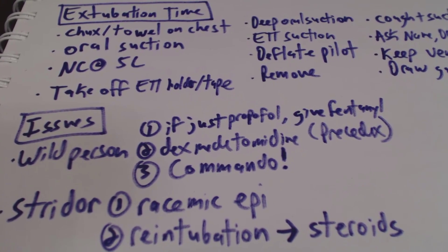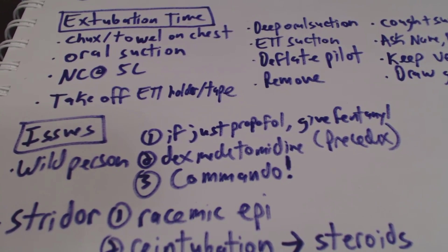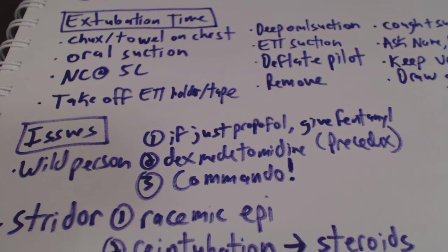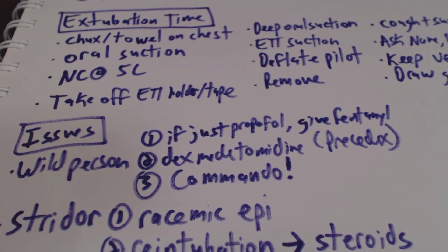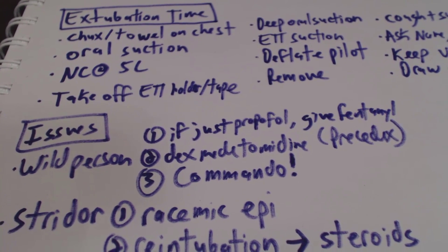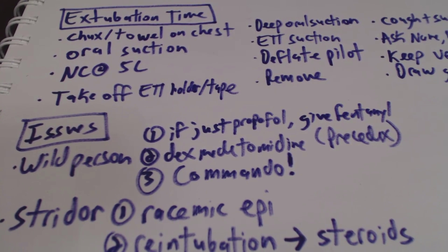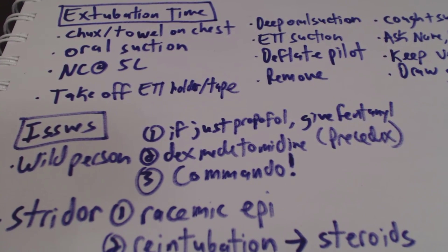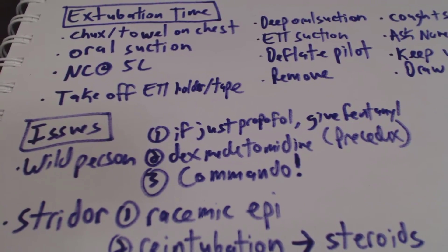Sometimes the propofol fentanyl or the dexmedetomidine will not work, in which case we're just going to have to commando. And this is my favorite, just because usually we'll have a fellow or an attending there, and we can't just extubate with no parameters. But if a patient is fighting that hard, more often than not, we can figure out that they will be able to protect their airway, and they'll do okay with it. Because sometimes they just wake up, they feel the tube in their throat, can't think clearly, and they just go nuts. And sometimes, as soon as you pull the tube out, they're fine. They're like, man, I didn't like that.